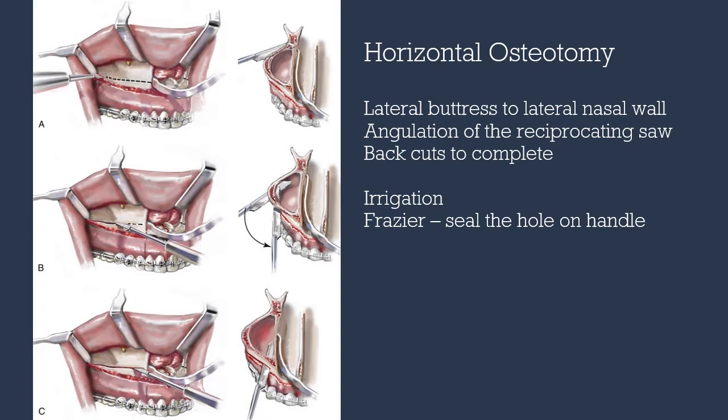The horizontal osteotomy is completed with the reciprocating saw going from lateral to medial. We want a second assistant to irrigate and suction. As we move medially, we want to angle the reciprocating saw more and more parallel to the lateral nasal wall.